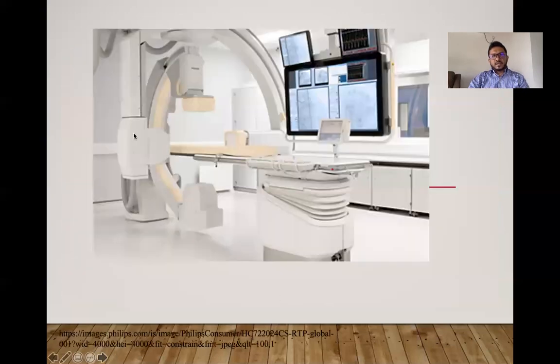This is basically a biplanar cath lab, which is available in Sri Lanka and available in the North as well. These are needed for cerebral interventions, especially AVMs, but for the rest of the things, I think just a monoplanar DSA would be more than enough to do those procedures.